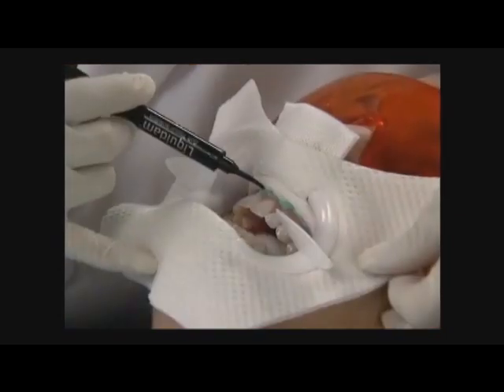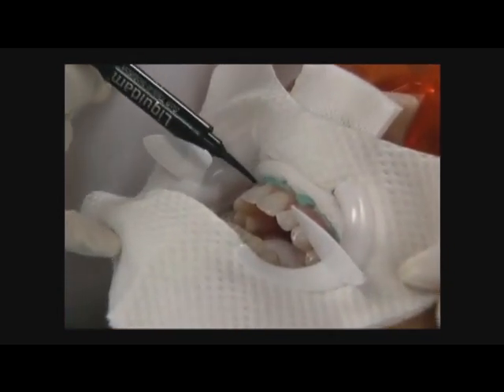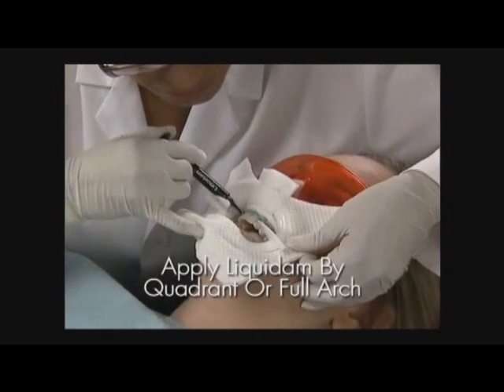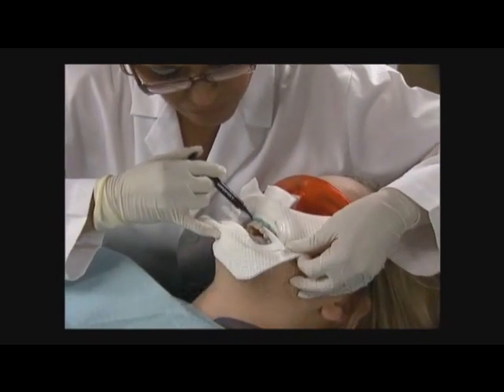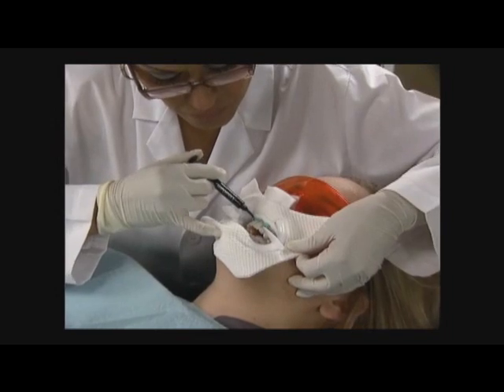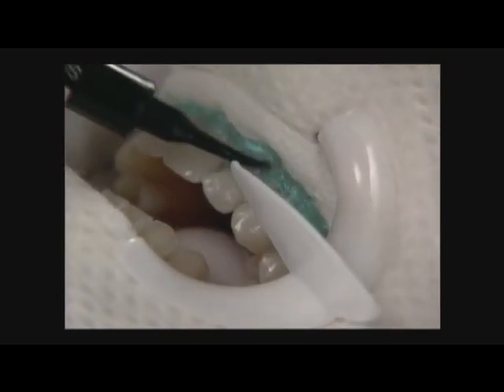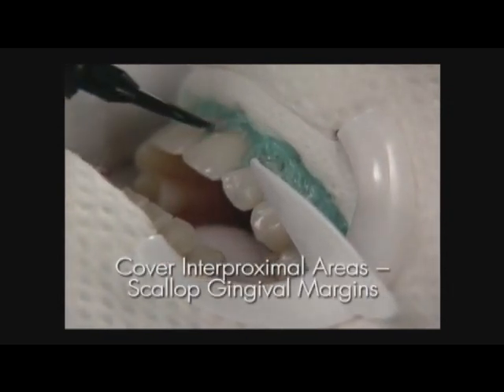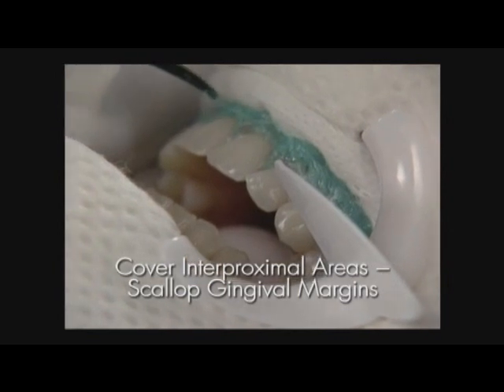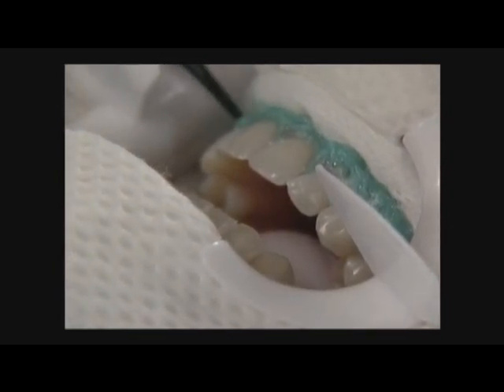Begin by applying the dam along the gauze in the upper vestibule to form a seal. Apply to the full arch, or at minimum a single quadrant for proper coverage, manipulating and extruding the material as you go. Make a second pass along the margin, scalloping the gingival margin to ensure full coverage. Be sure to cover all interproximal areas, sealing the Liquidam to the enamel. All dentin should be covered.